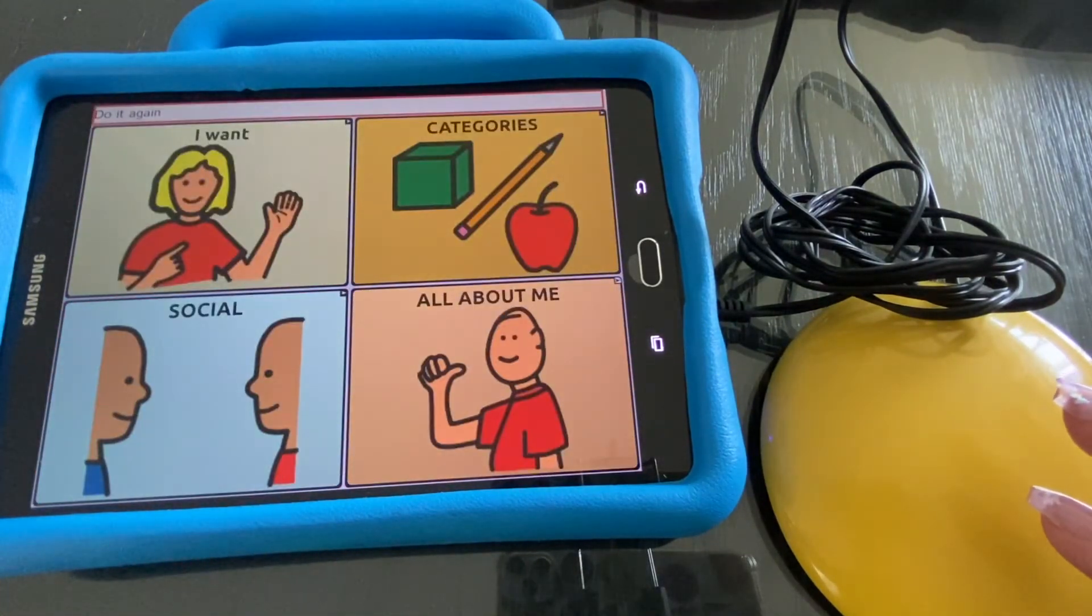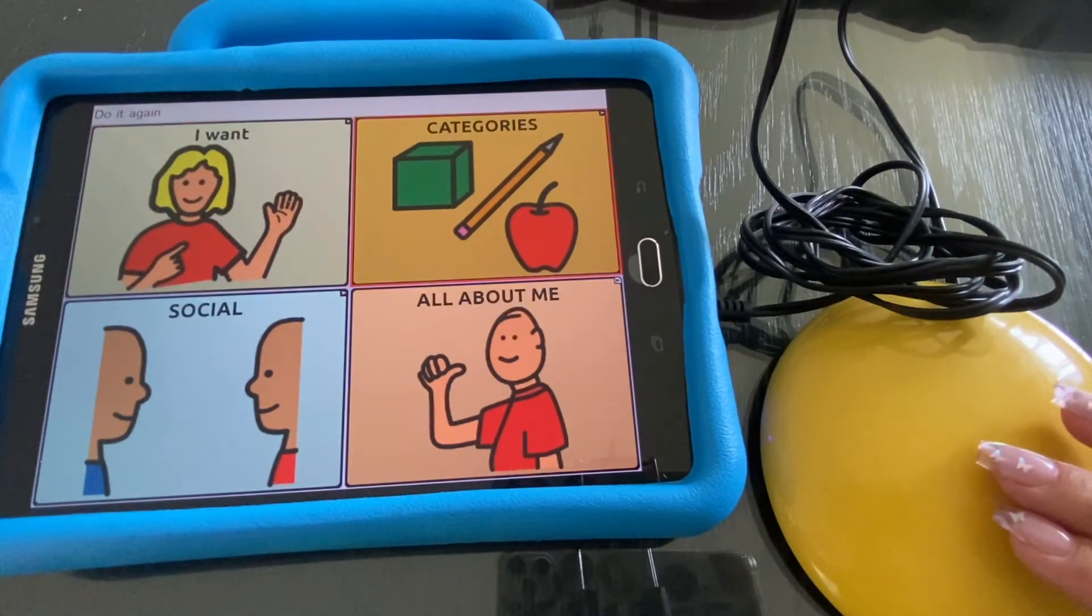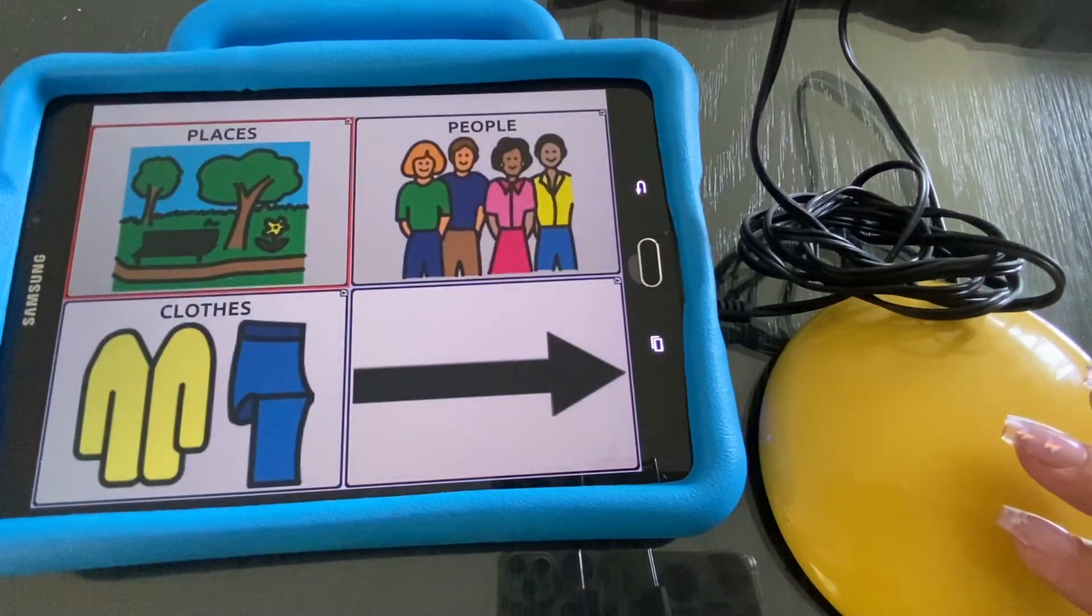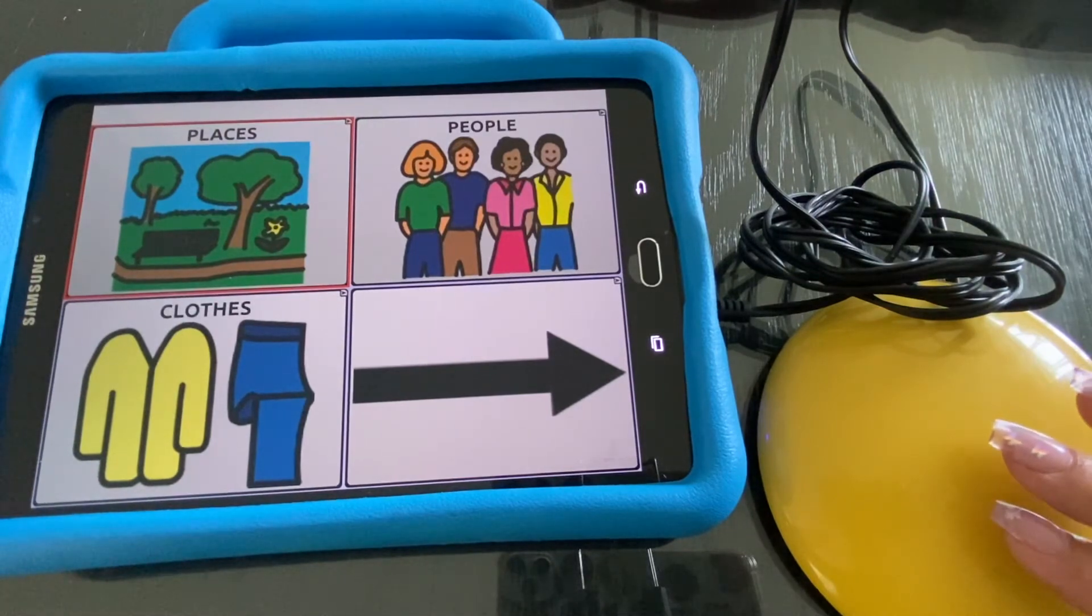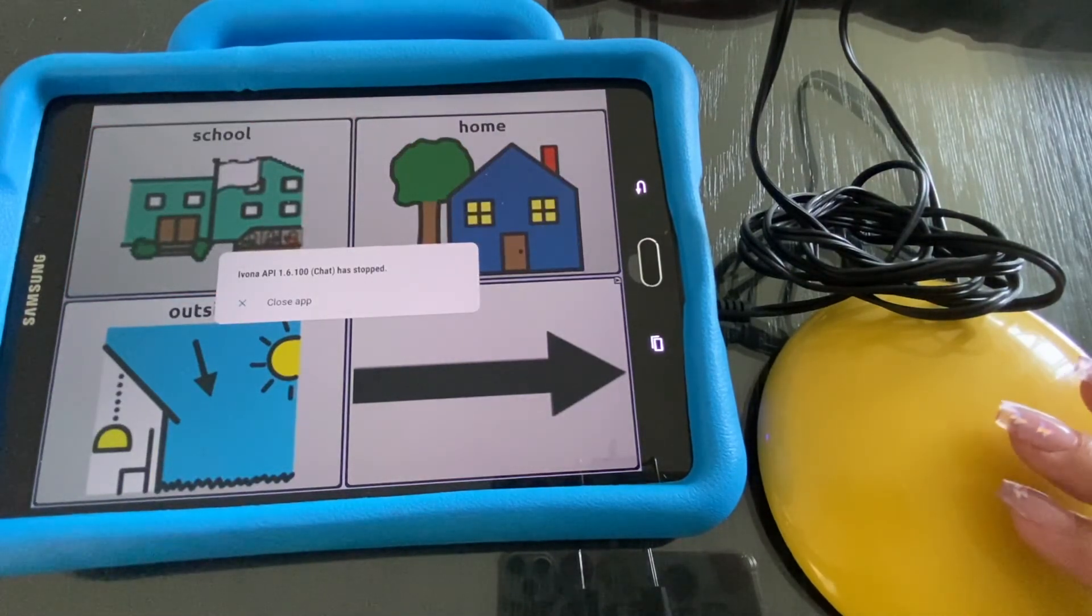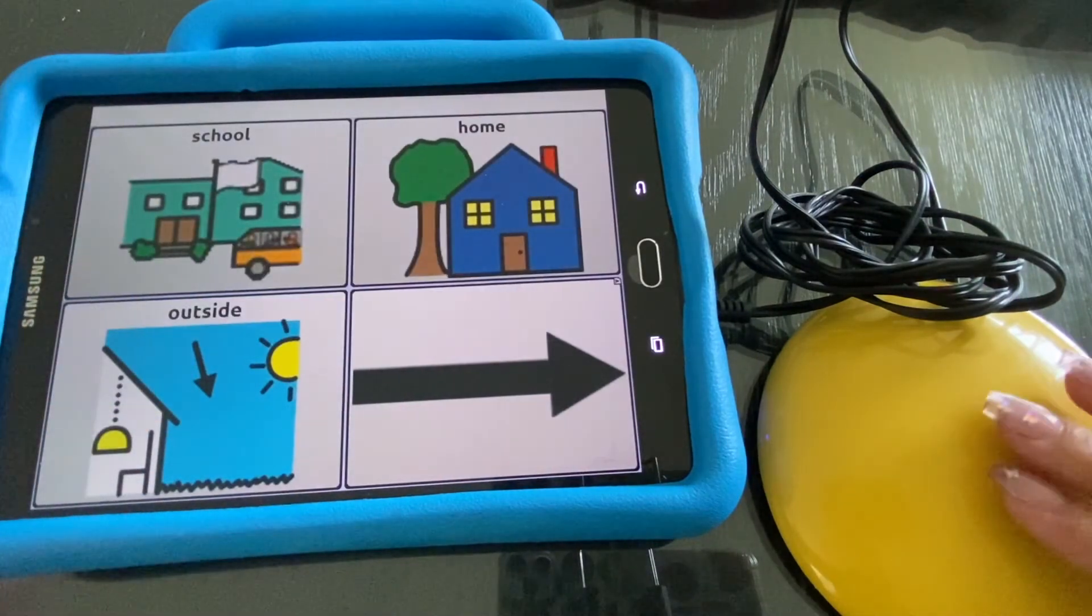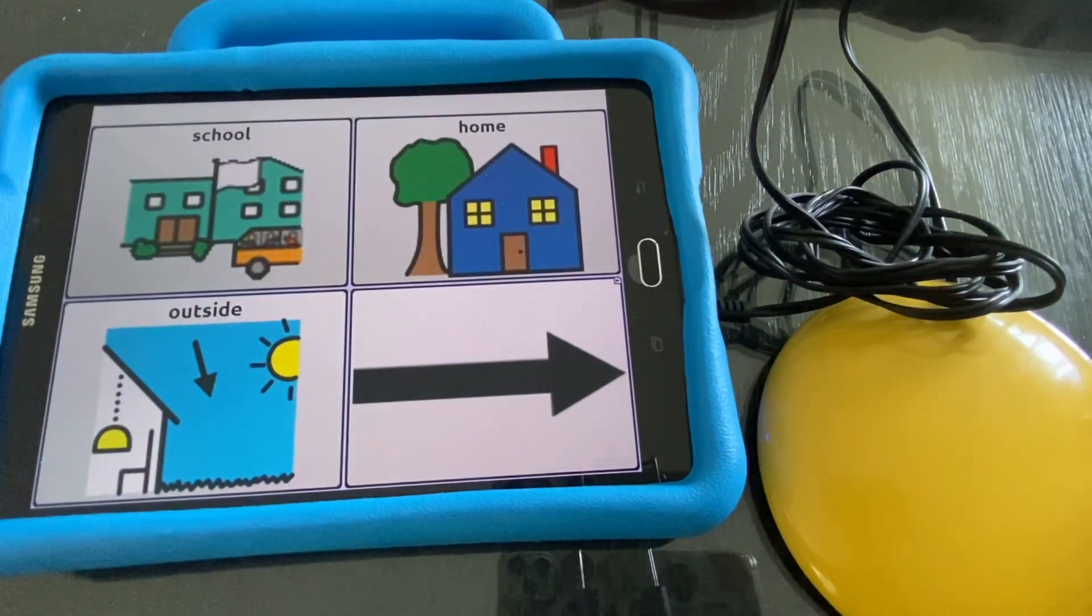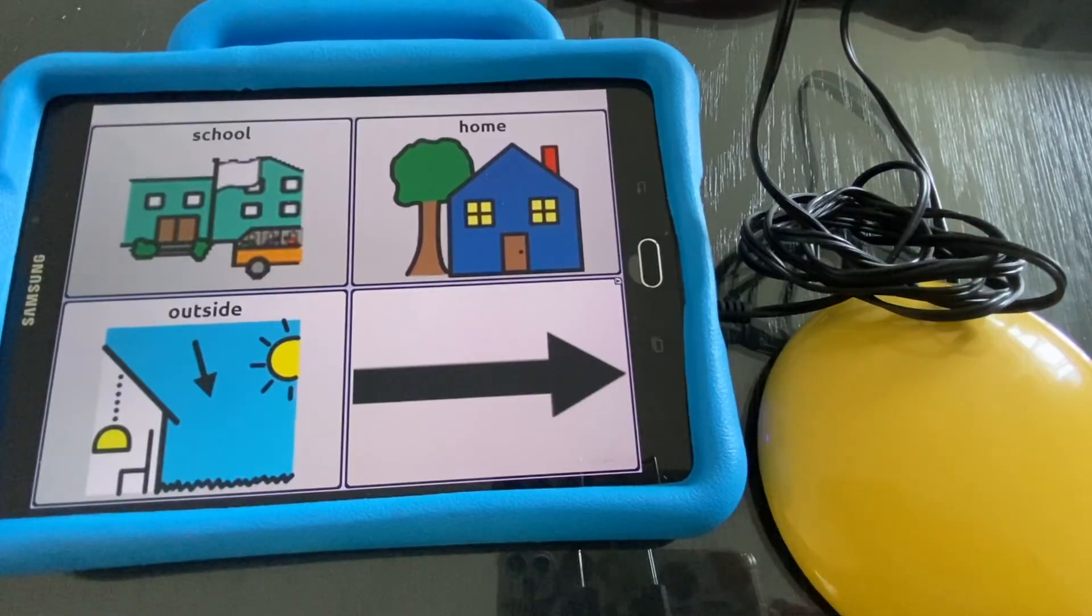And that's how you use auditory scanning.